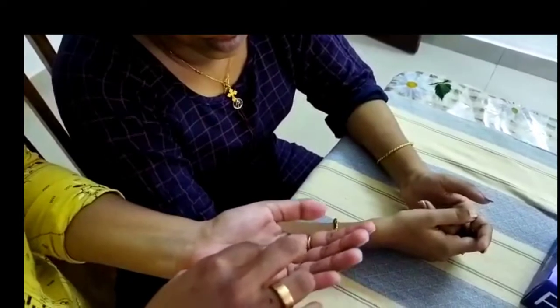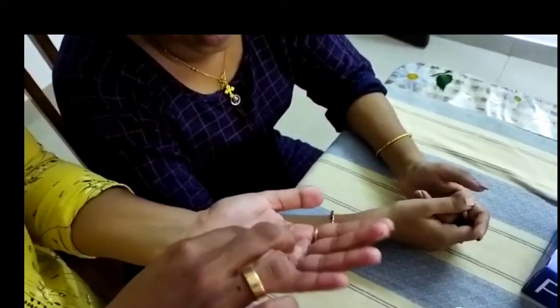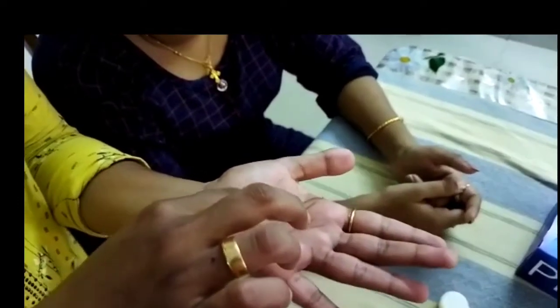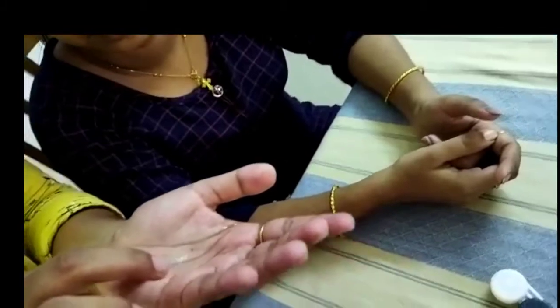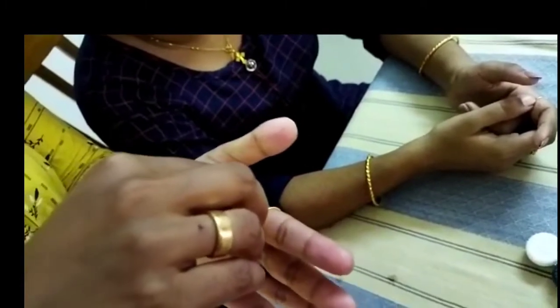Before placing the contact lens in the patient's eye, we should check to ensure the lens is perfect. The patient is already using minus 0.75 diopter in the right eye, and the left eye is plano.